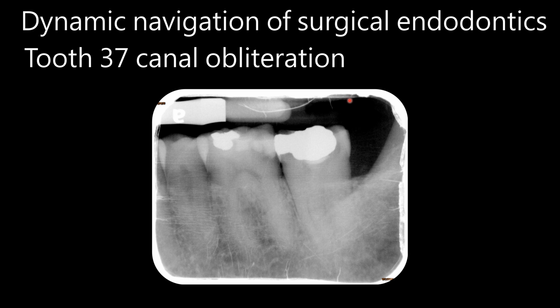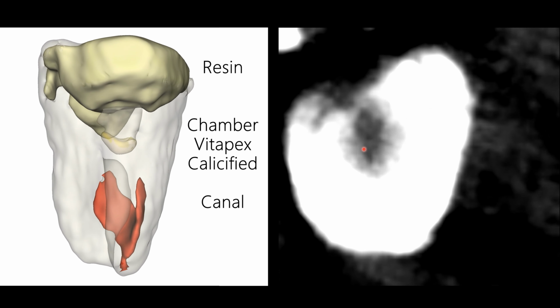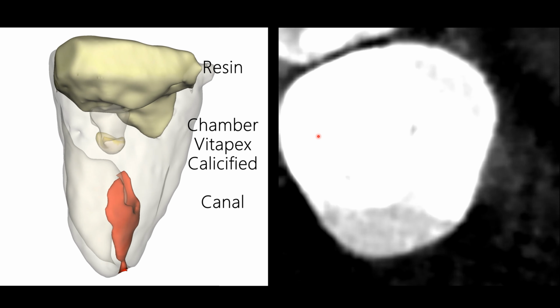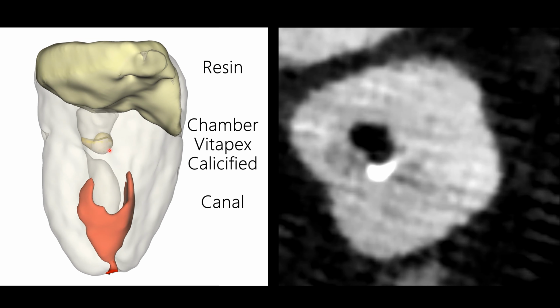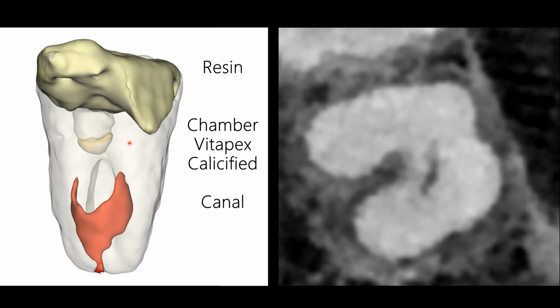So a patient came to our department complaining about soreness of this tooth. So we decided to do the endodontic treatment for this tooth. And after I opened this tooth, I could not find the canal. So before it's too late, if I perforate it, it's too late.